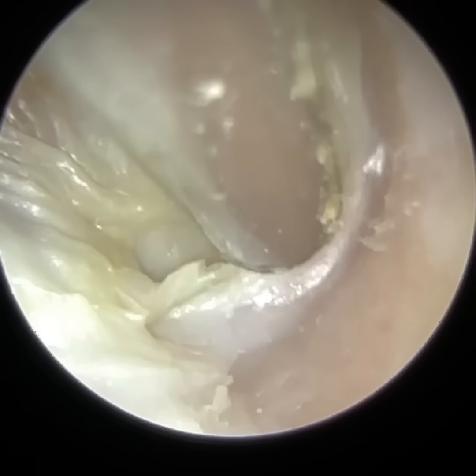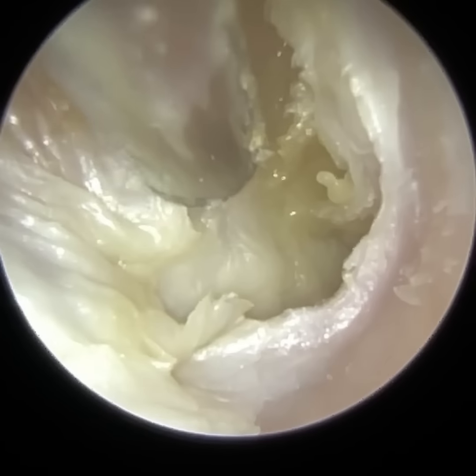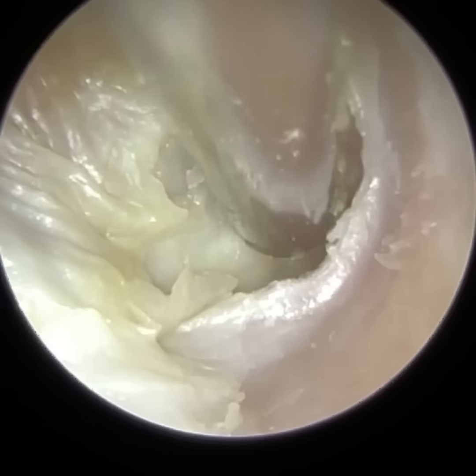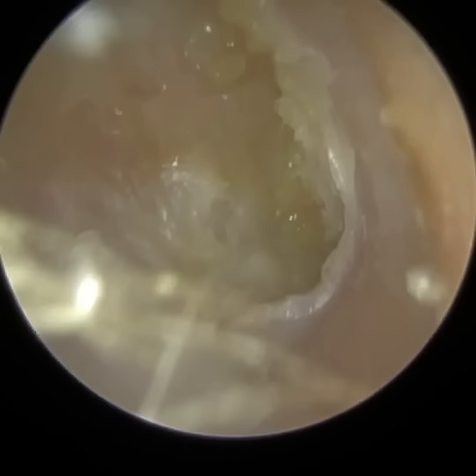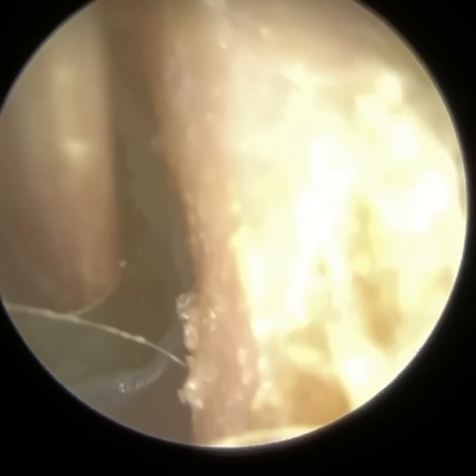This patient is very diligent. They don't allow water in the ear. They do use acetic acid spray just to help reacidify the ear if it's slightly more neutral or even alkaline. So we want to retain that natural pH.